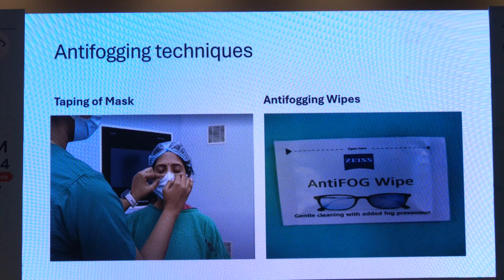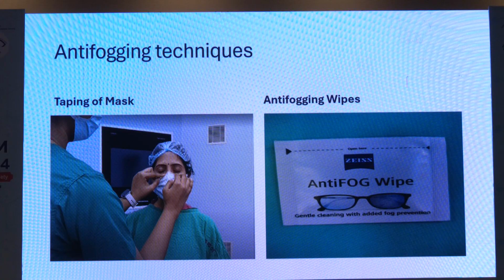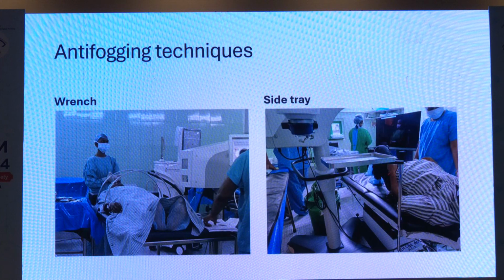If you're wearing spectacles, you will have fogging on your spectacles first. Again, there are these anti-fogging wipes that have come. So clean all the lens surfaces, whichever you can see, clean with that, so the mist will not fix on them.